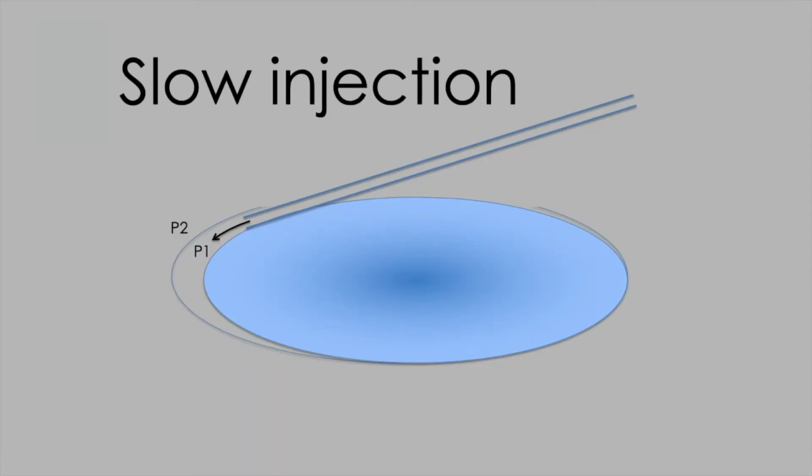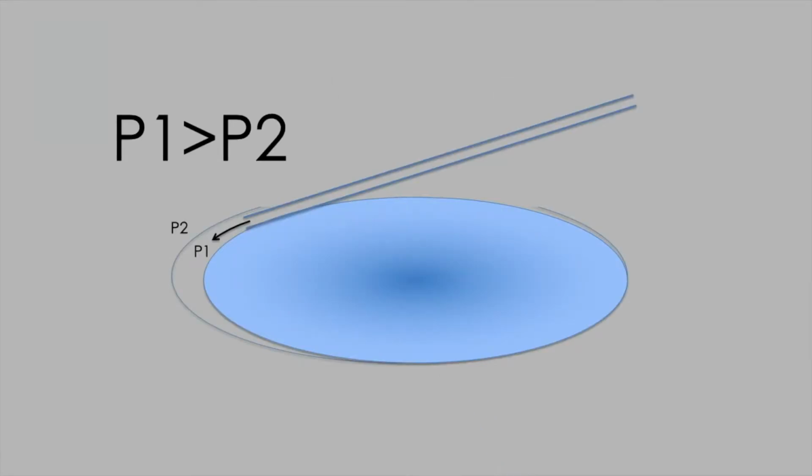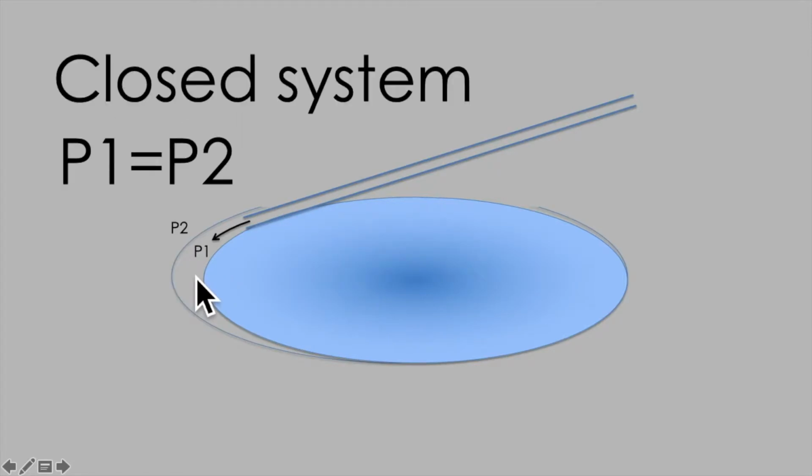Let us further examine how this works. So we commence the injection. The purpose of slow injection is to promote free flow. Now, why is this important? To make this technique work, you have to localize pressure differential between the inside and outside. If you have anything blocking the entry side around the hydrocannula, you will get a closed space. The pressure throughout the volume will be uniform.